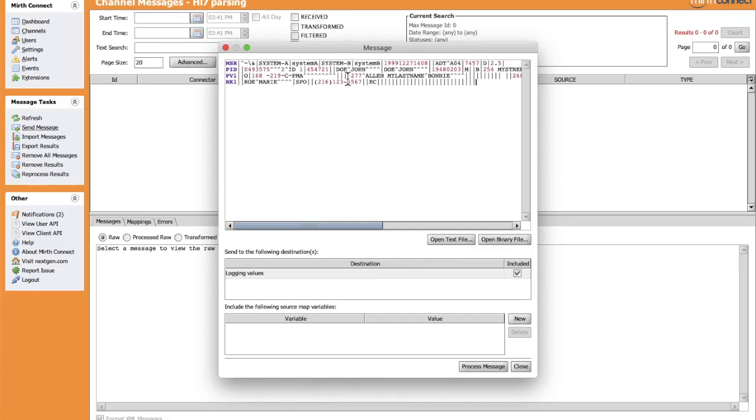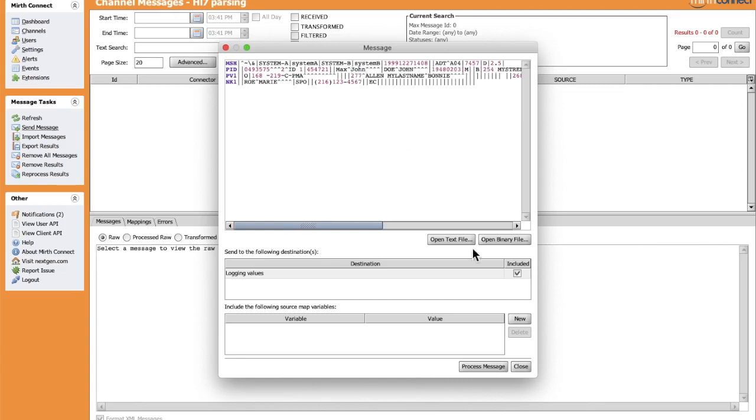Let's change, for example, the first and last name of the patient. Let's process the message.